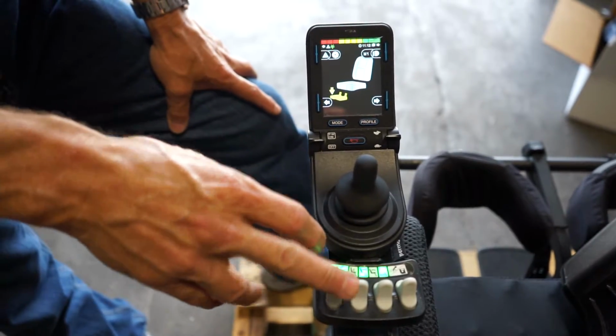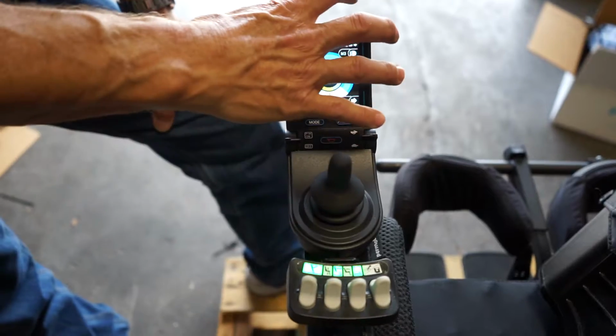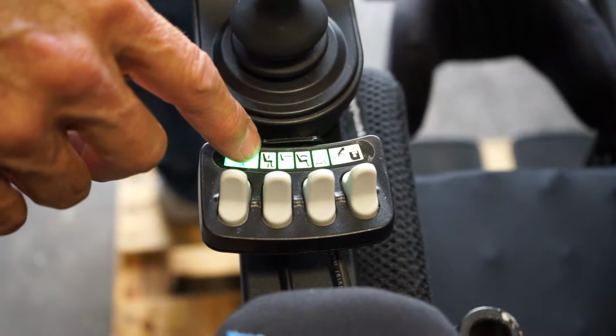So let's go back to, let me put this back in drive. All these buttons can do the same thing here. So you've got the standing position, the first one. The second one is not lit up. It's called the seat lift.